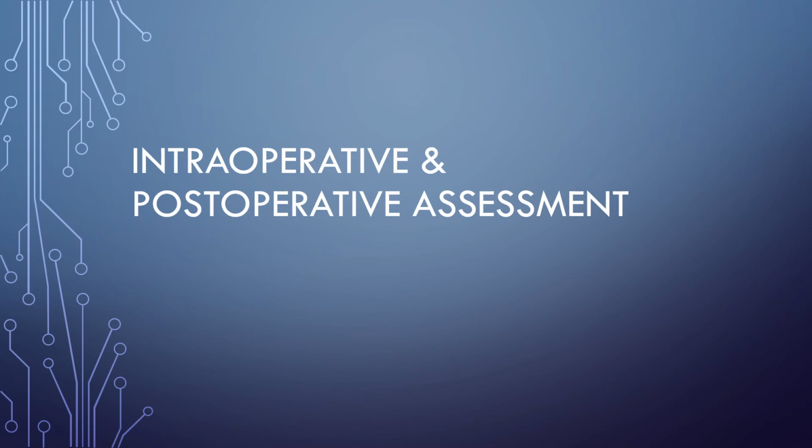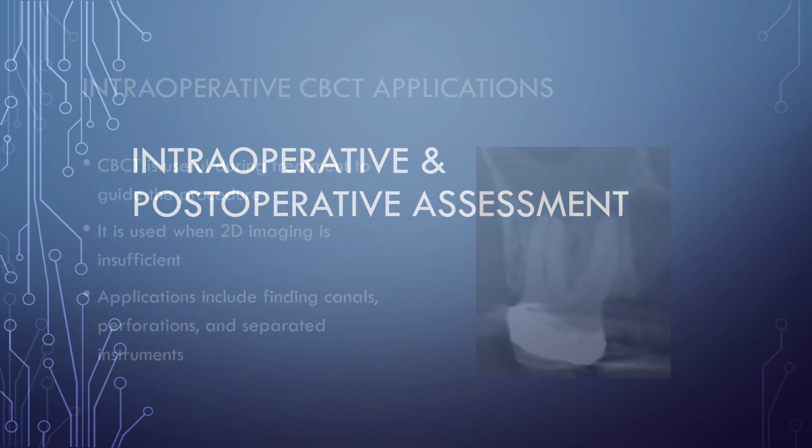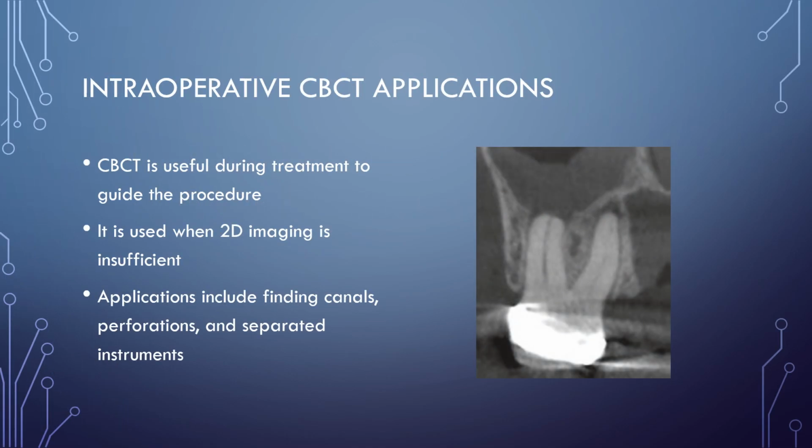Intraoperative and postoperative assessment. During an active endodontic procedure, several sudden complications can arise that are exceptionally difficult to manage with 2D imaging alone. An intraoperative CBCT scan can serve as a powerful adjunct in these high-stress situations when standard imaging leaves you guessing.